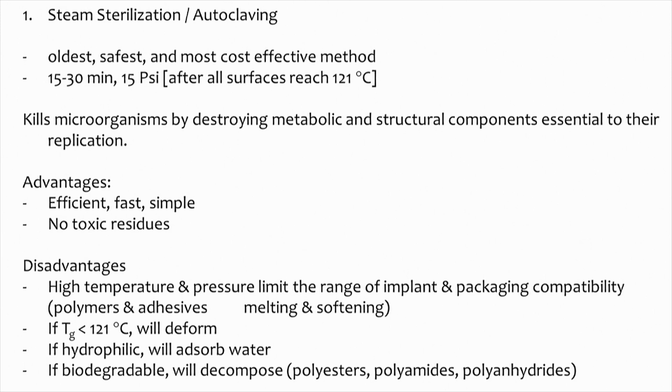The easiest is steam sterilization. This is the oldest method, the safest method, and it is very cheap. That means we do it for about 15 to 30 minutes at 15 psi, so we can reach about 120 degrees. It kills microorganisms by destroying metabolic and structural components essential for replication. Advantages: it is very efficient, fast, simple, and does not leave any toxic residues.